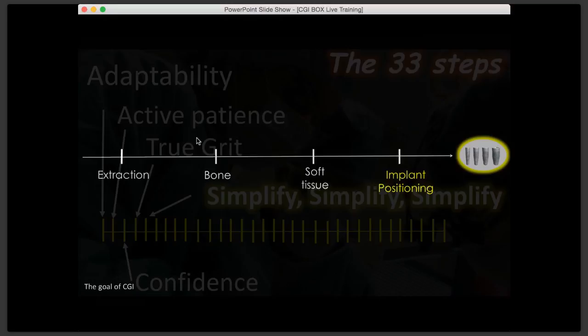That allows you to place your tube above, which creates another problem. The other problem is, as you'll see in a second in the case, occlusion, you need to use extra long drills. Okay, so just be aware and don't get disappointed.